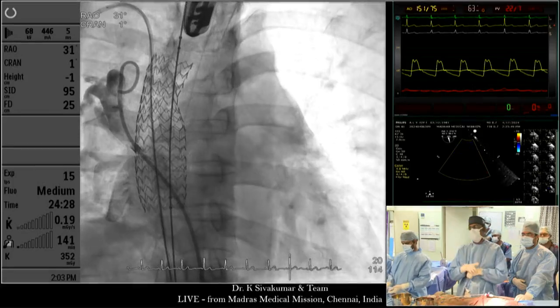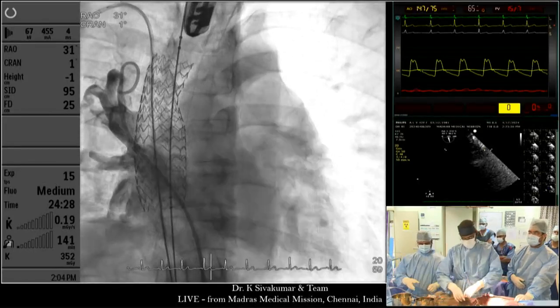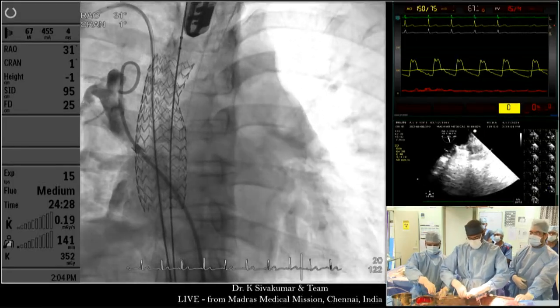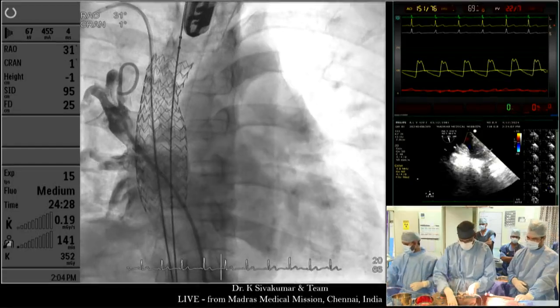We already saw that the pulmonary venous flow on Doppler was laminar with flow reversal. Show the spectral Doppler once again. I'm giving you simultaneous right upper pulmonary vein and left atrial pressure. Can you give me an artery forceps?